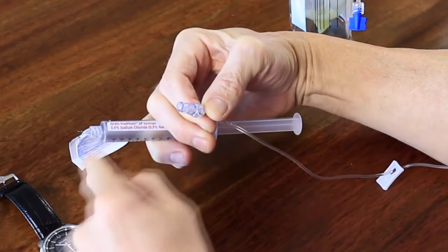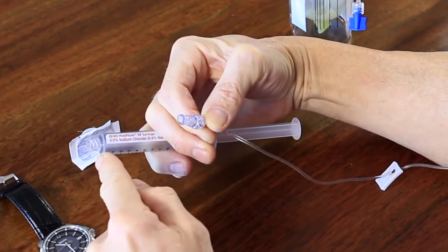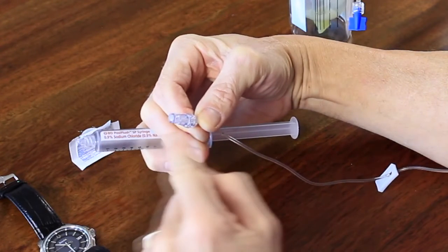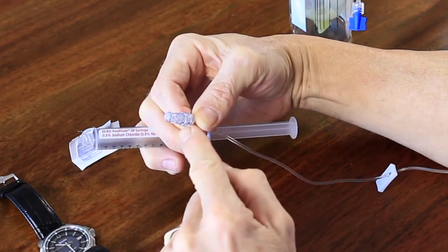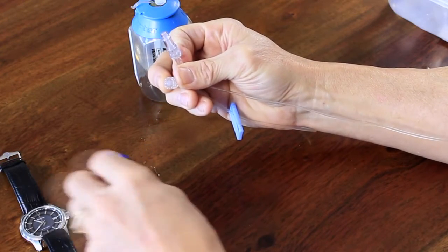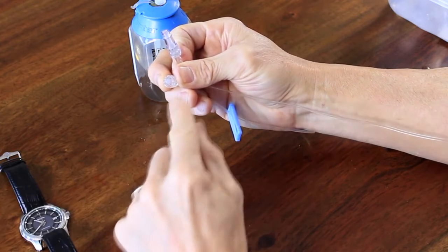You need to know that there are a few areas that you cannot touch, or you may allow germs to get into your bloodstream. I call them the three no-touch zones. Number one, never touch this open tip of the flush. This is a no-touch zone. Never touch the cap on the end of your IV once you've cleaned it. It is a no-touch zone once it's cleaned. The only thing that can touch these no-touch zones are other no-touch zones. The third no-touch zone is this open end of the bottle tubing. It is a no-touch zone.